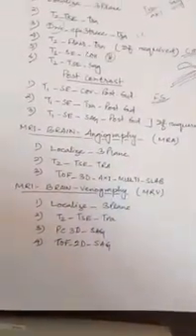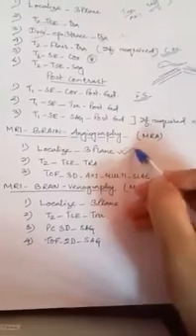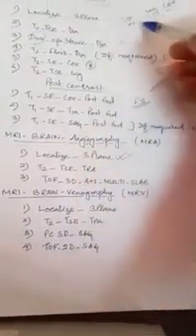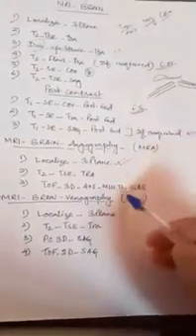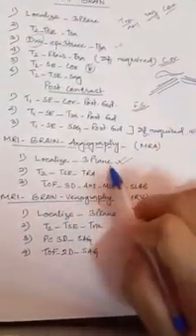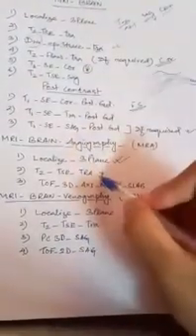Okay, next, if any angiography, that means any vessels we have to see, then again we have to take one localizer plane. In that plane, as I already told you, we have axial, sagittal and coronal sections. If you are doing it in a continuous process, then no need to take this axial; from this axial you can plan.